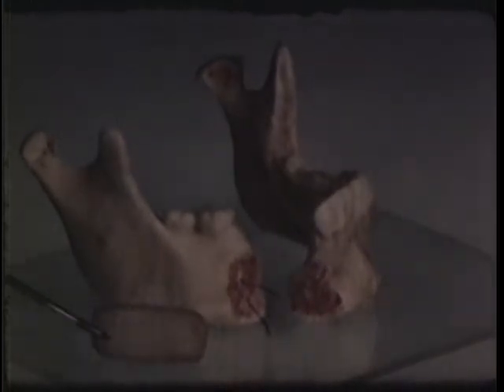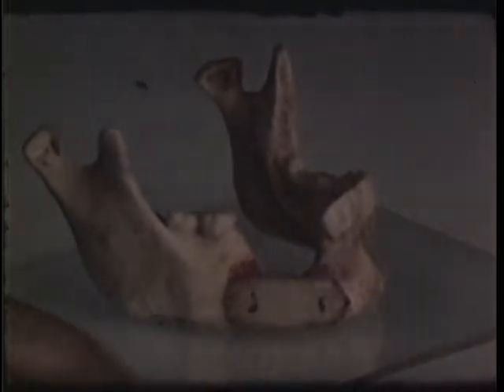The graft procedure to be followed in this case is demonstrated on a moulage. A pre-shaped piece of bone will be grafted to the fractured ends to join them together. The bone ends are prepared for the graft and wires are passed through holes drilled in the bone ends to match corresponding holes in the graft. O-14 tantalum wires are used to seat and hold the bone graft. For the actual graft procedure, endotracheal anesthesia is used — nitrous oxide and oxygen with curare for relaxation.